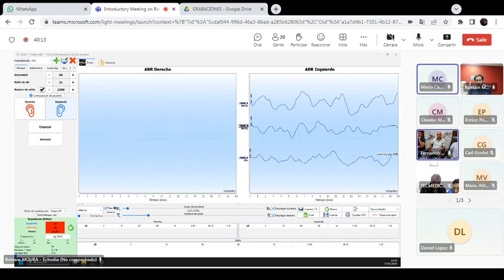I think the requirements in terms of intensity are very basic, and also the range of frequency for BC is smaller than a standard. So do you think that we can enable this part just on one unit in order to let them prove that they can achieve this also?